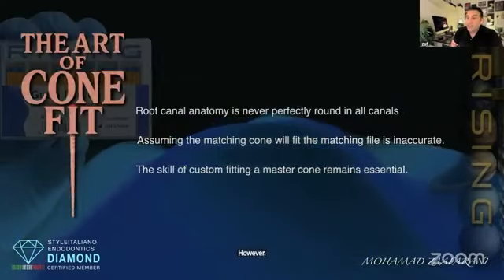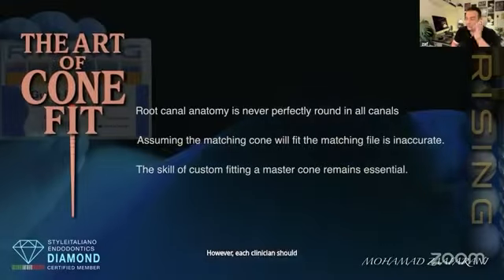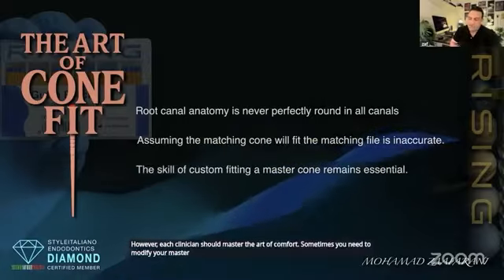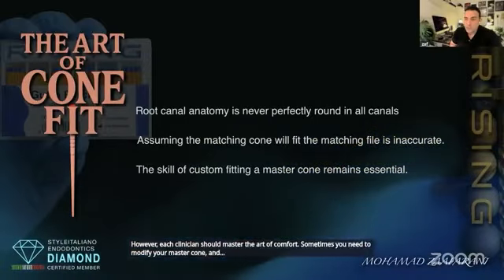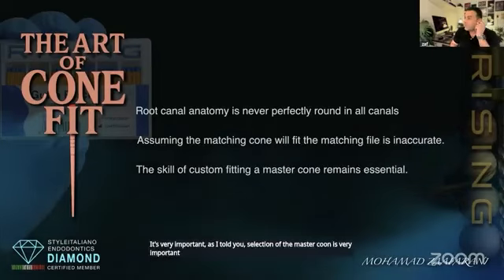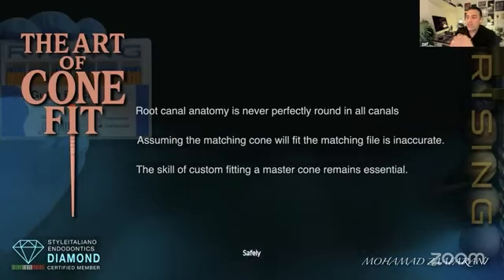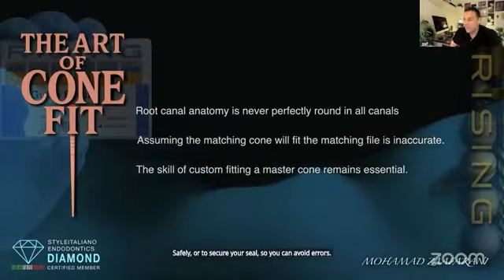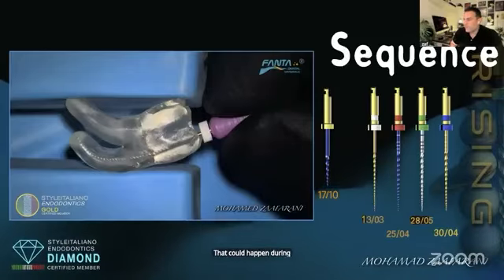However, each clinician should master the art of cone fit. Sometimes you need to modify your master cone, and it's very important. As I told you, selection of the master cone is very important to secure your seal, so you can avoid errors that could happen during the obturation phase.